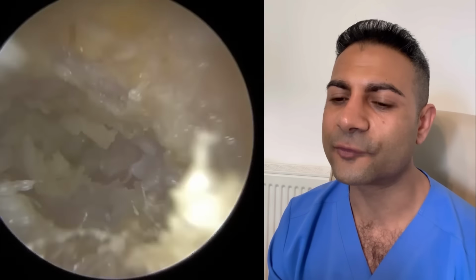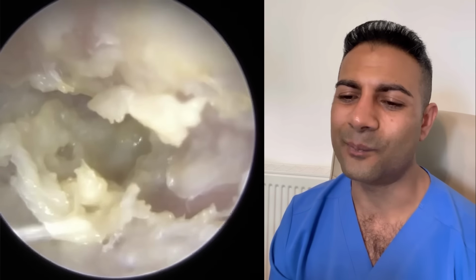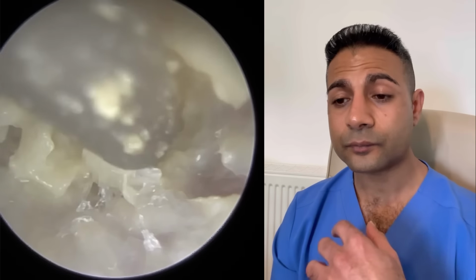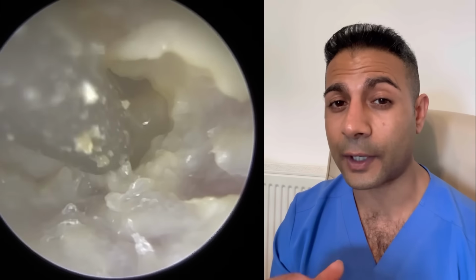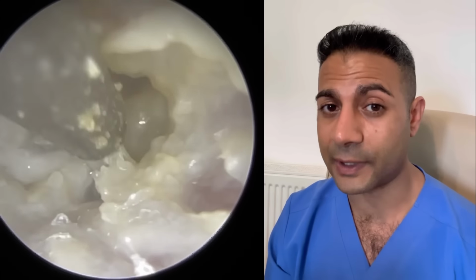We all have that urge to scratch and itch, but by scratching this, it's going to make it worse for two reasons really. First of all, when you scratch the ear, you're going to abrade the surface layer of skin, and when you do that, you're going to allow the bacteria and fungi to further penetrate into the deeper layers of skin.